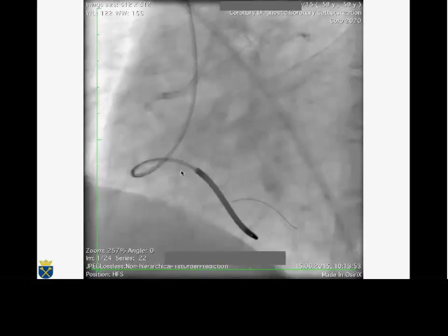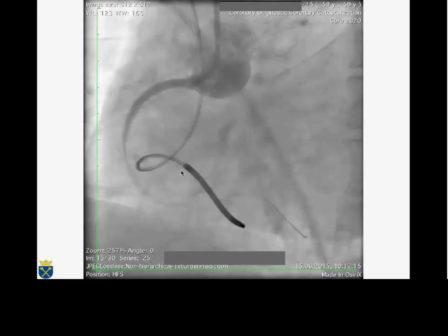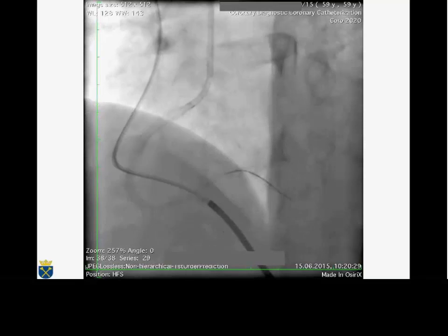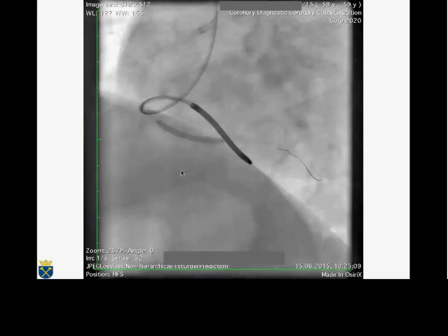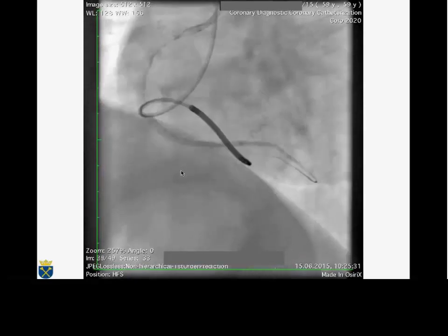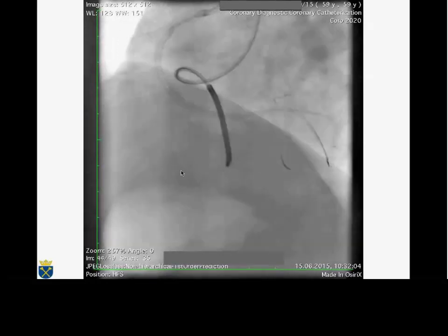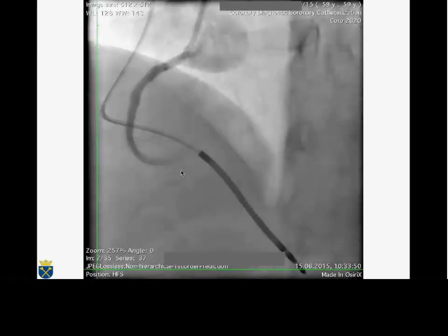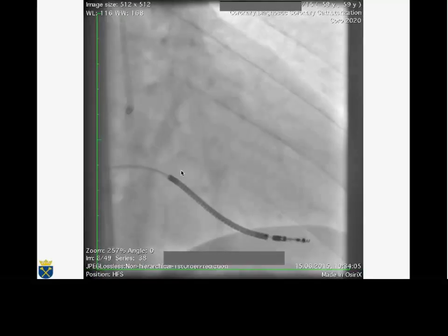And after that, of course, we stented first the proximal part of the vessel, then the distal part. Of course, sometimes after some minutes or hours of working, you find that the occlusion is not the end, because as you see in this case, the PDA was also occluded, but I was able to wire the PDA and to finish with the kissing wire technique, having such results at the end, so preserving both branches and the whole artery.